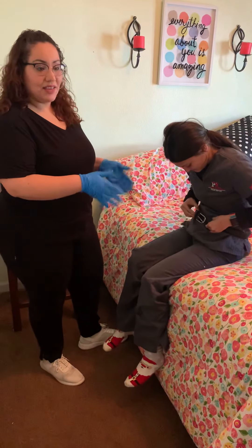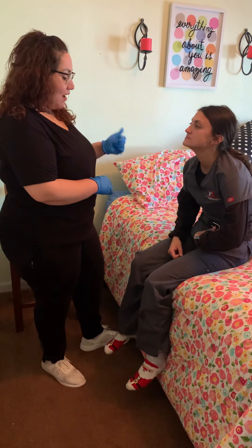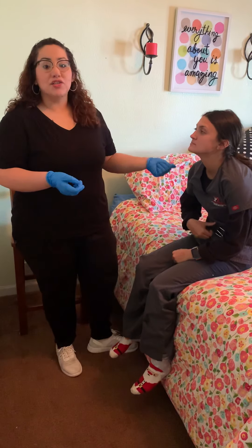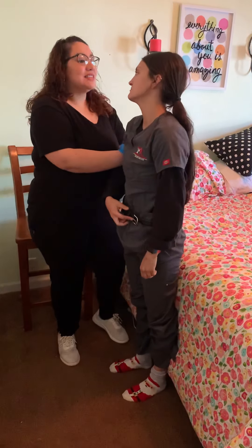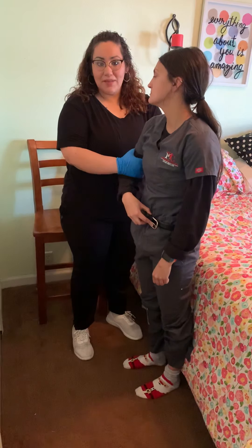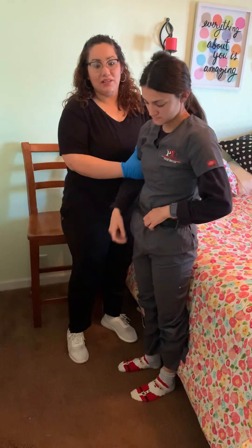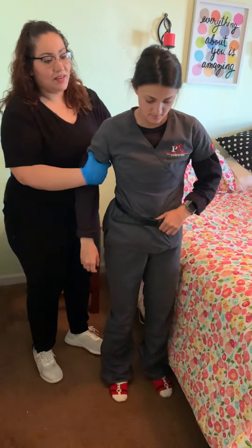So then I'm going to go ahead and put the gait belt on. The gait belt — you have to make sure to put it on snug, not too tight. Make sure that you can put your two fingers in between. And there you go. So it's on her now. I'm making sure, once again, that she's aligned. She's good to go.